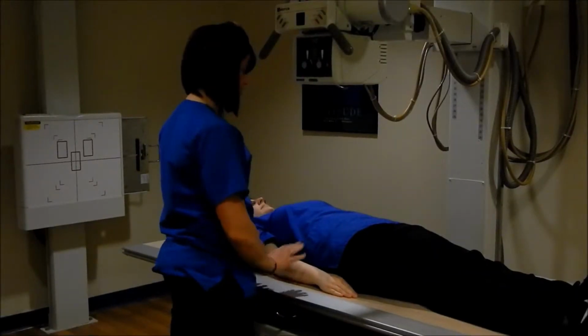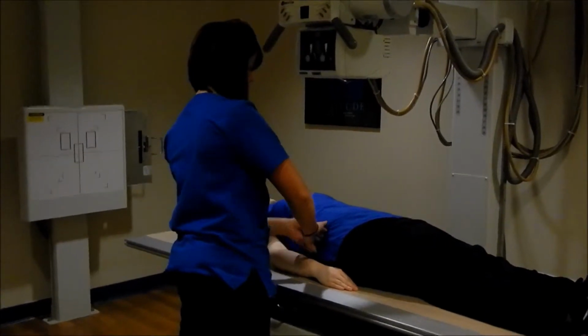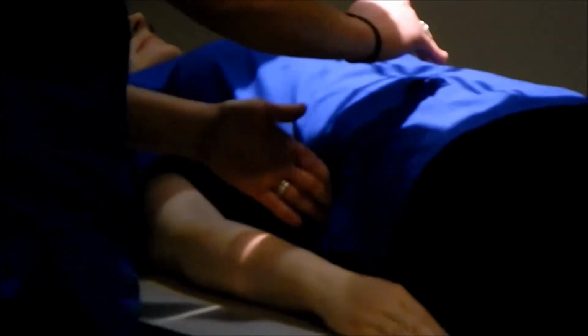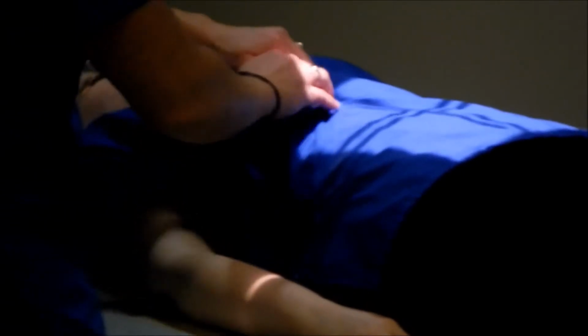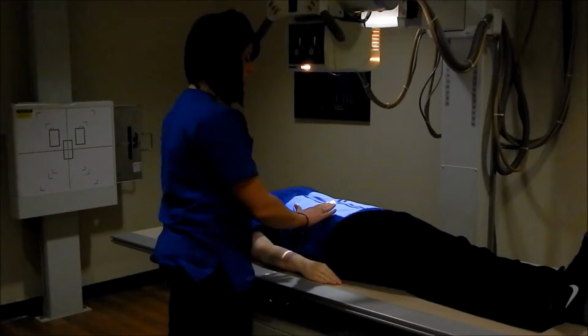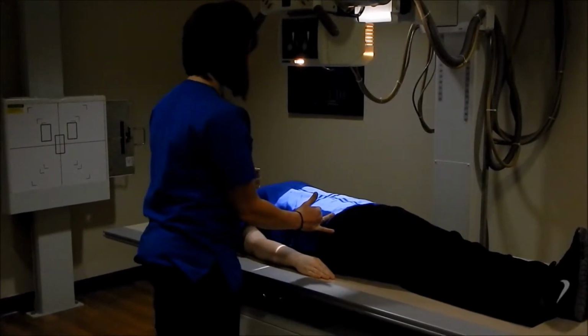The next thing you want to do is feel for their ASIS, and feel around to the top of their crest, and that's where you want to center, along with their mid-sagittal plane. So I'm going to move her a little bit here. To check for the mid-sagittal plane, you can always feel along the ribs to the xiphoid tip to know that you're in line. You also want to make sure that you're getting down low enough, so you're going to palpate for the symphysis pubis. You're just going to do one quick check with your finger. We've got it covered, so we should be good there.